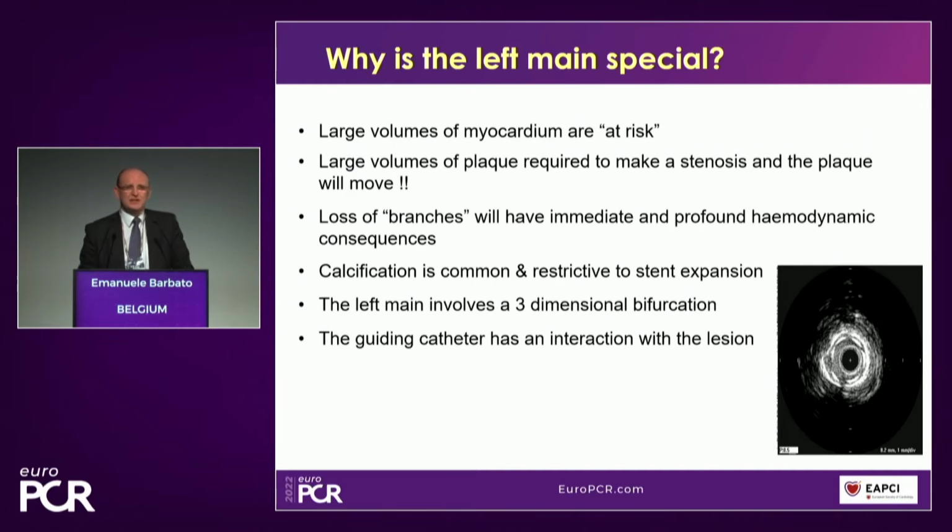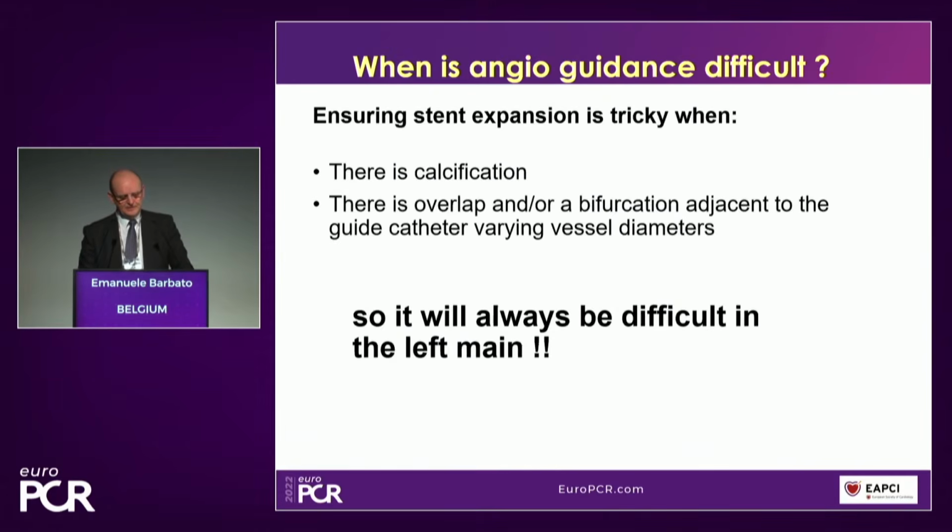And importantly in this session, we recognize that most left main will involve calcification. And of course, most left main involves a bifurcation, and most left main will involve an interaction with the guide catheter, which makes it not unique, but challenging.